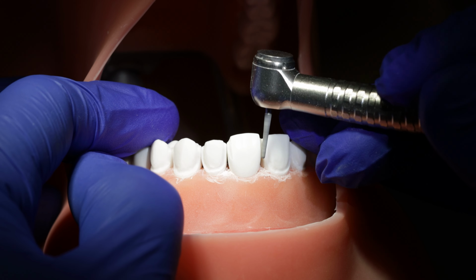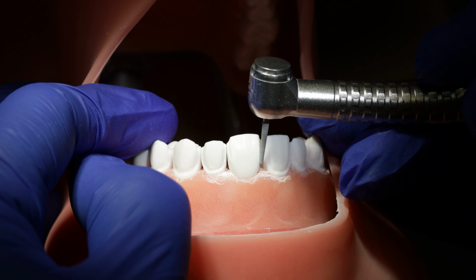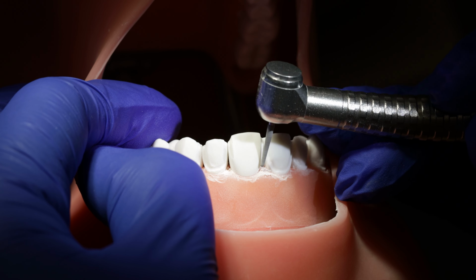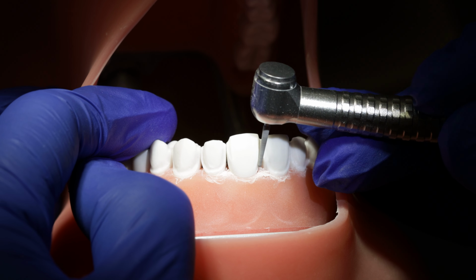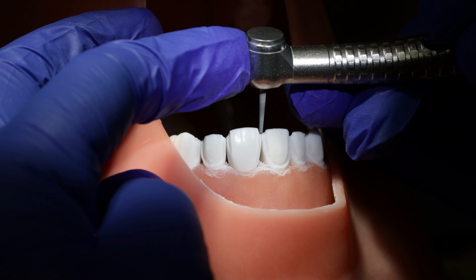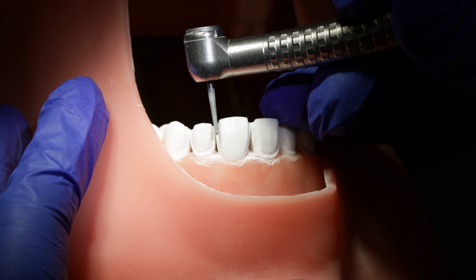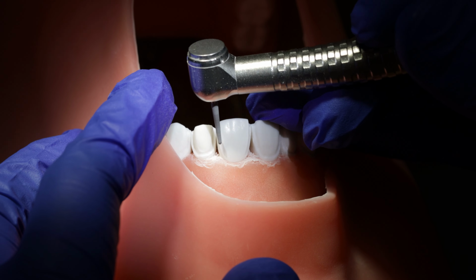previously. And while we're here, I'm going to take the tip of my red chamfer burr and drag it down cervically to make that mesial marginal reduction. Here you can see me do the same thing distally, and later on I will drag the tip down and marry the two gingivally.